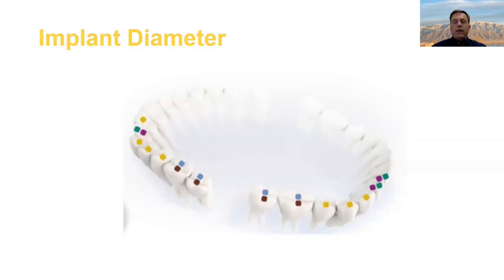But we want to keep in mind these implants, I mean, you could read the instructions on them. They're not designed for posterior teeth. They're not designed for bridges. They're designed to support only single teeth. So we need to make sure that if we're using these implants, we're using them in the very limited indications that they're for. Let's set those aside now and talk about what we might call normal implants, 3.2 or bigger, basically.